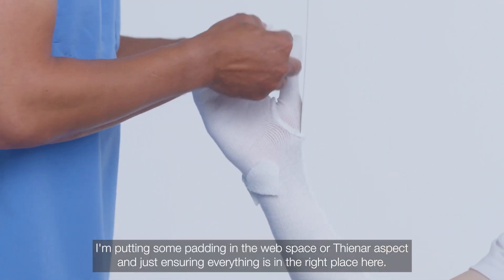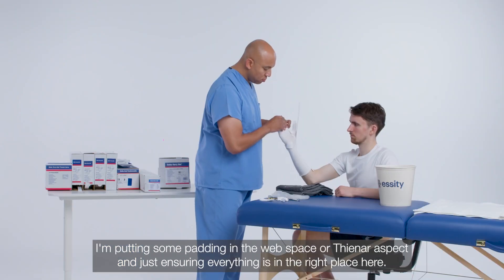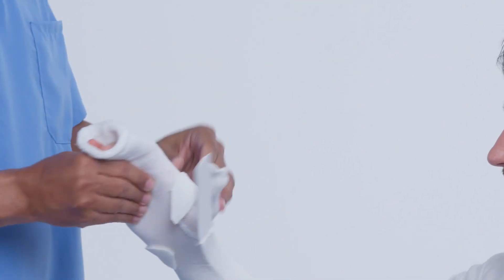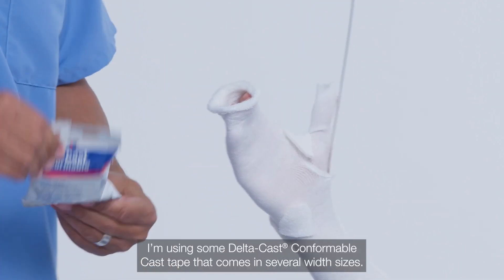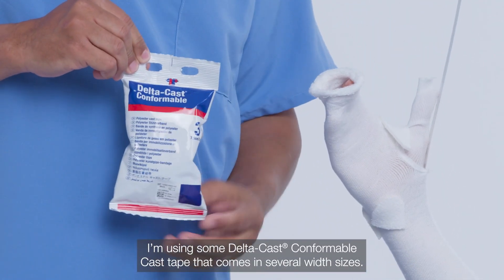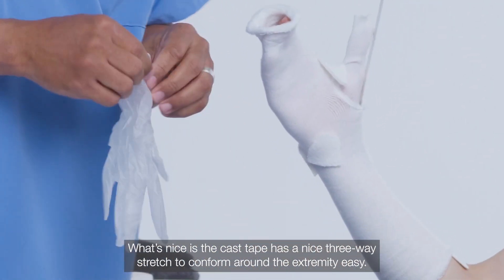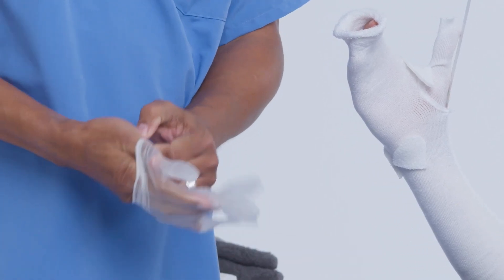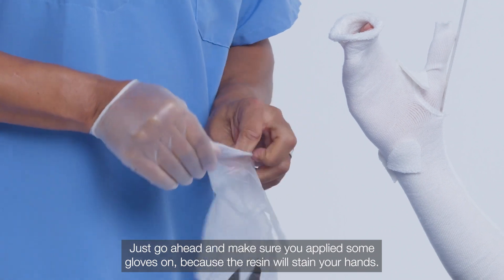I'm putting some padding in the web space or the inner aspect and ensuring everything is in the right place. I'm using Delta Cast Conformable cast tape that comes in several width sizes. The cast tape has a nice three-way stretch to conform around the extremity easily. Make sure you've applied some gloves, because the resin will stain your hands.